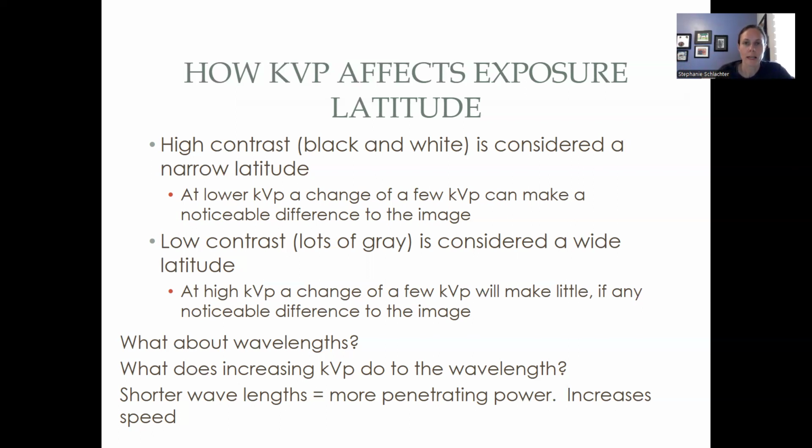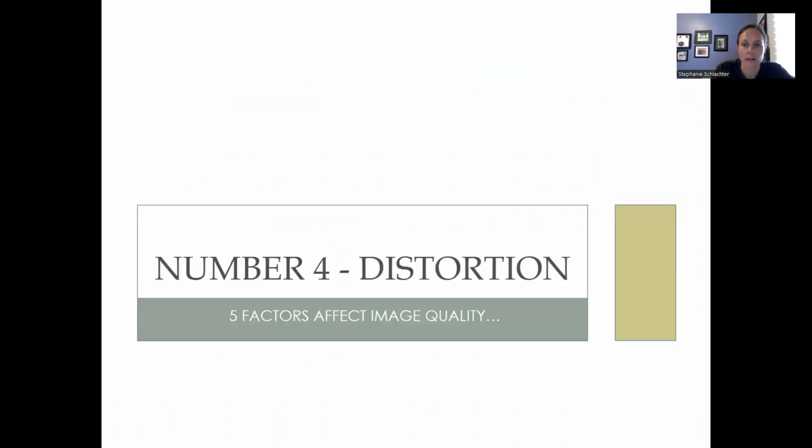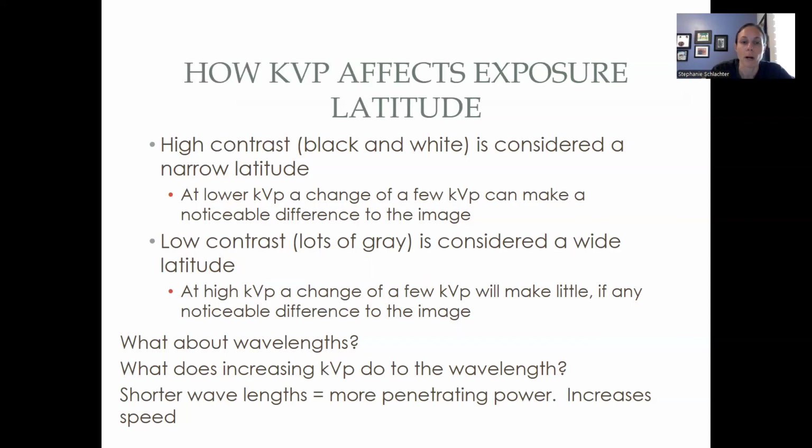When we talk about wavelengths for our KVP or for our radiation, if we increase our KVP, our wavelengths actually get shorter. Okay. And we know the shorter wavelengths penetrate through things much more easily than longer wavelengths. So we have to keep that in mind.